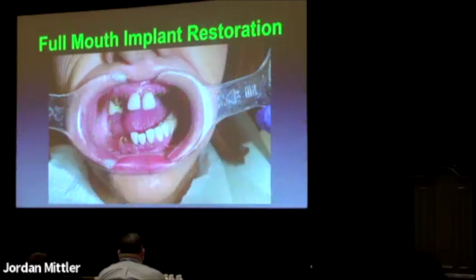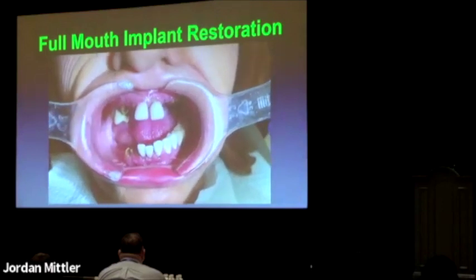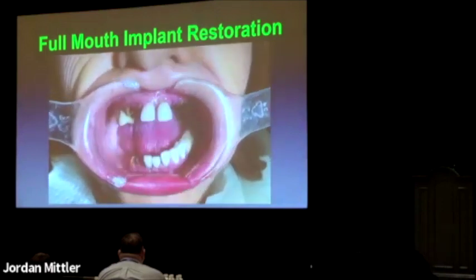So now, second patient. This is the mother of the dental student. Okay? And this is how she presented to my office. Let's see if we can get that video to play, because this is an important one. There we go. Okay, just close up and down. So here's checking her occlusion.